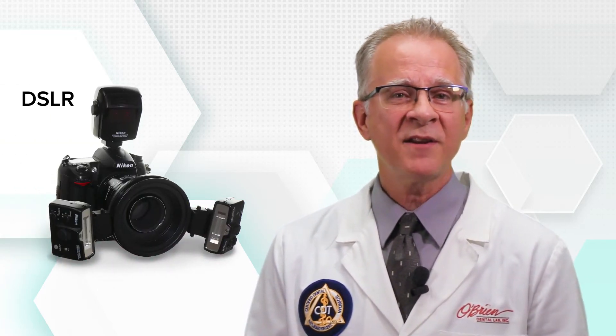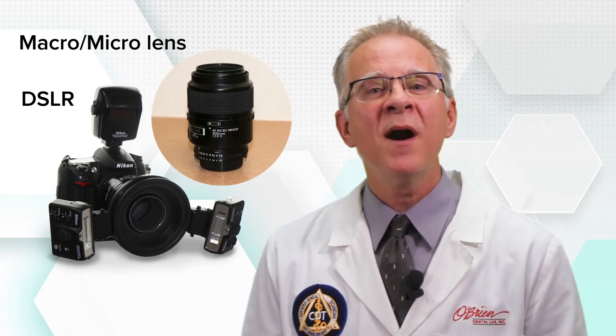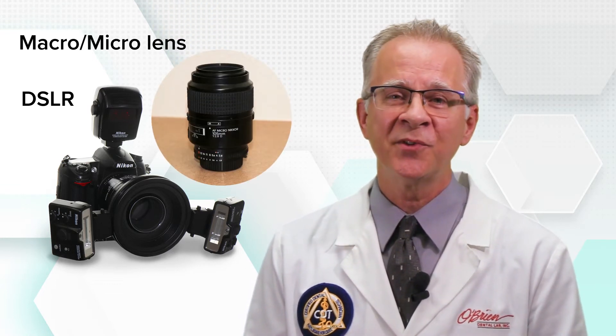Here also is the need for true macro photography rather than just close-up. All you want in the frame are teeth, tabs, and tissue. So again, here are the tools of choice: a quality digital SLR camera, a true macro or micro lens, and a dual source flash.